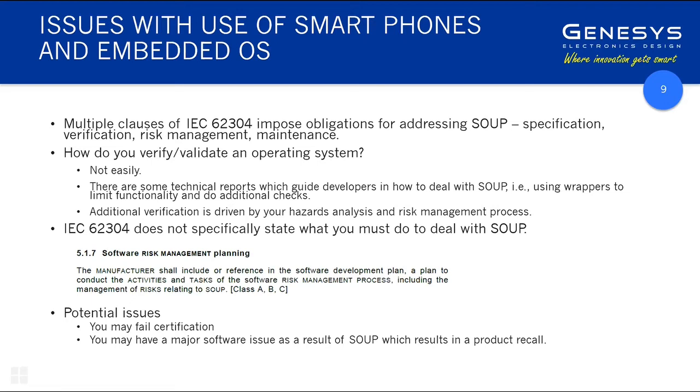But there are going to be lots of circumstances where it's okay to use one of these interfaces because it's not very time sensitive. It might be something you do after the operation, where you're just managing your data, and it's okay if it goes down because you can just reboot it and redo it again. So what's the bottom line here? When should people rule it in, and when should they rule it out?